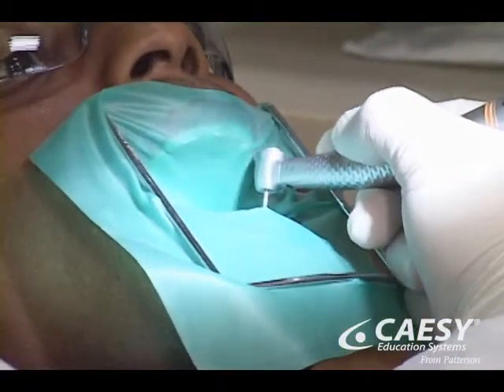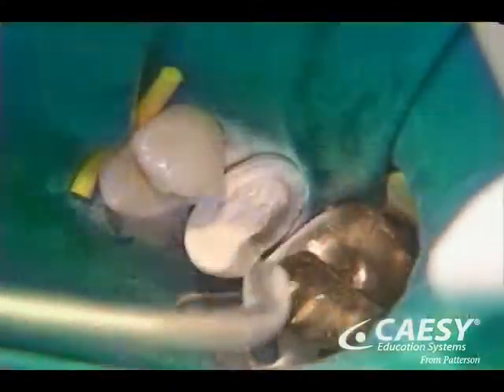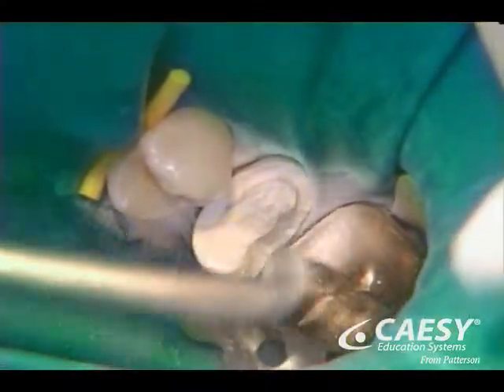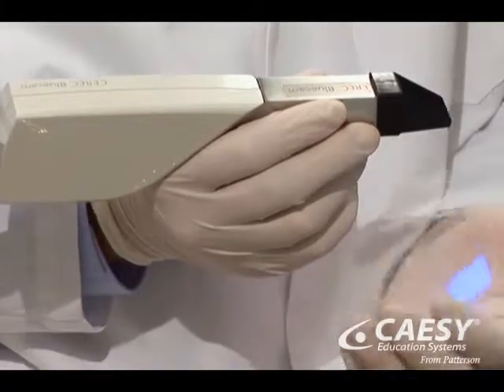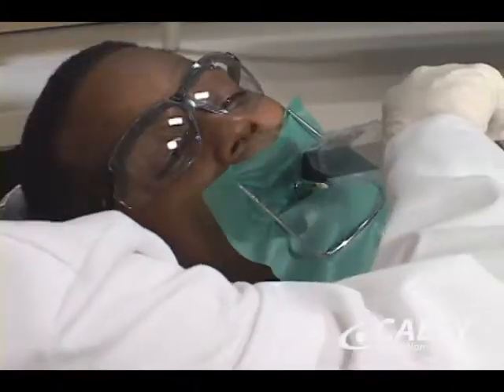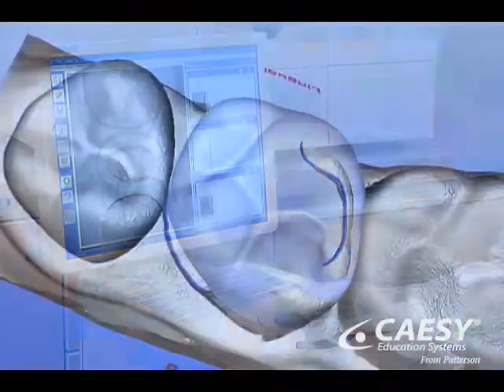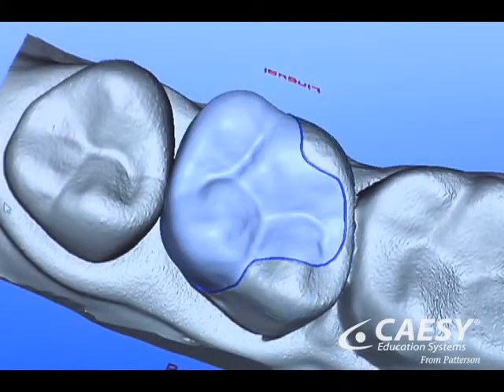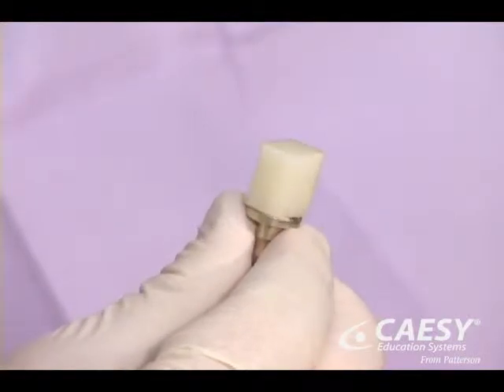The first step in the CAD-CAM technique is tooth preparation. The second step involves applying a reflective powder onto the prepared tooth. We then take a digital image using a special optical infrared camera that records the tooth's exact dimensions directly into the CAD-CAM computer. After we carefully design the restoration, we select an appropriate material of the proper shade for your specific tooth.